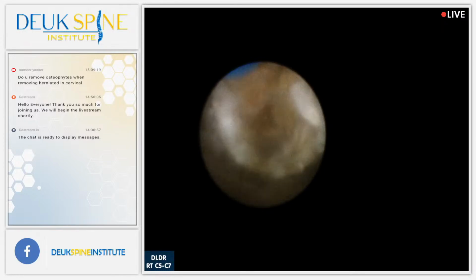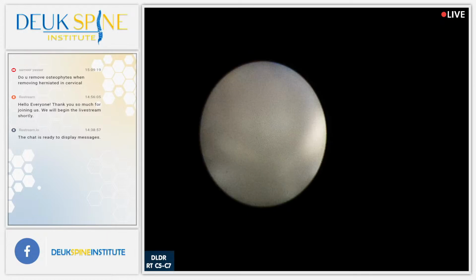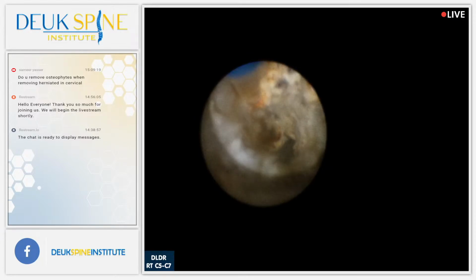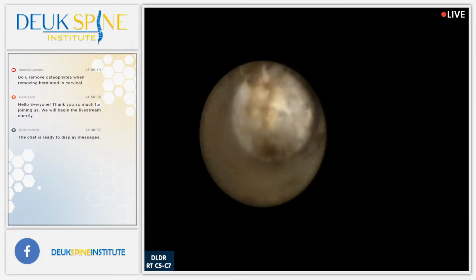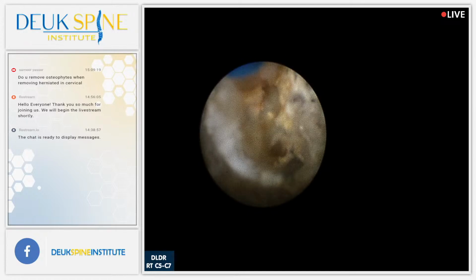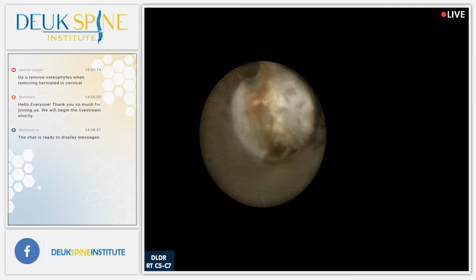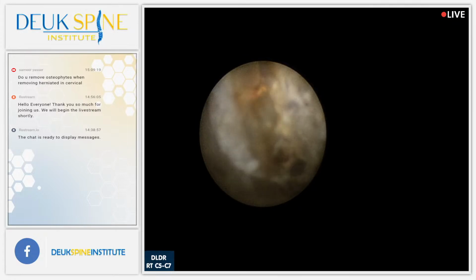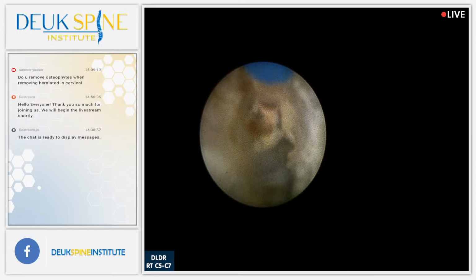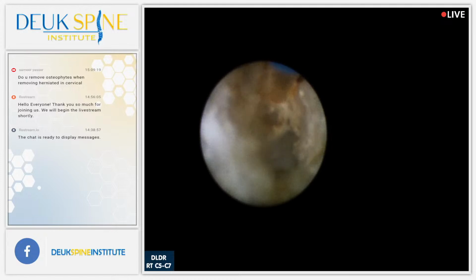We have a question. This comes from Samir on YouTube. Hi, Samir. They ask, do you remove osteophytes when removing herniations in the cervical? Samir, we're taking osteophytes right now. All of these things are osteophytes. That's what he has mostly is osteophytes. There's herniation and osteophytes, but a massive amount of scar tissue from injuries long time ago. This is all scar tissue and osteophytes right here.